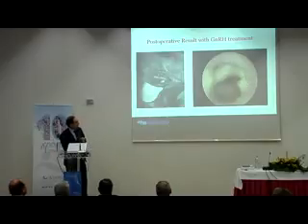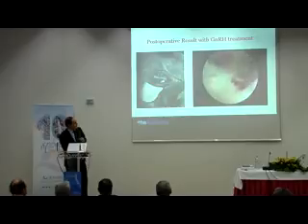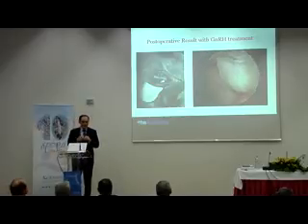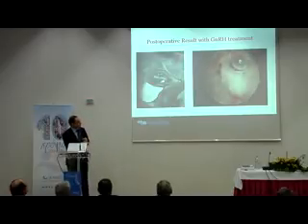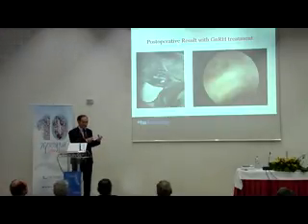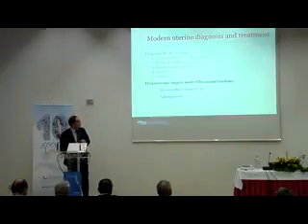After 3 months, she got drug treatment, GnRH analogs. That was the MRI. You see 1, 2, 3, 4, 5, 6 cysts. They were treated, and we see that independently of whether we do coagulation or cutting, we always have remaining areas where we have done the surgery. In contrast to the myoma, adenomyosis is a disease of the muscle, and if you cut a muscle, you will always have a residual lesion. So be careful, you can have adhesions.